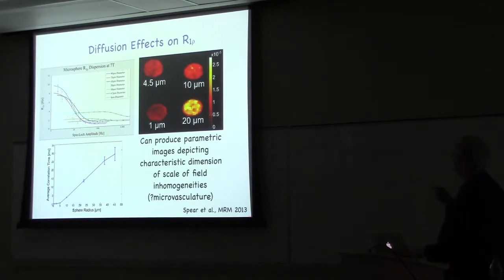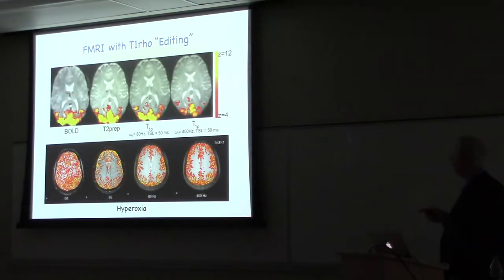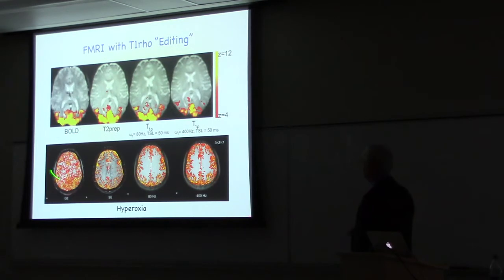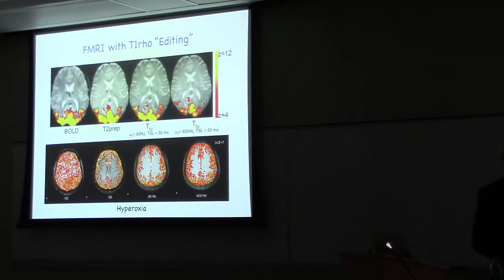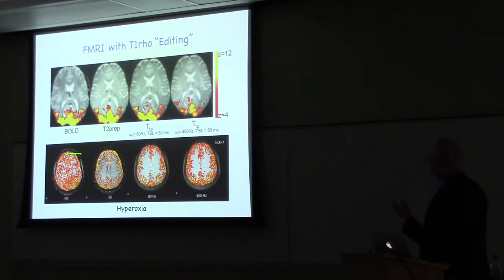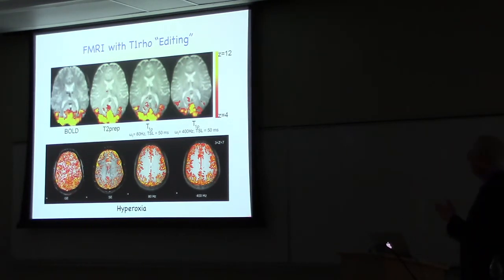When you do this with brain imaging, for example, this is somebody who's undergoing a breathing gas manipulation, so they become hyperoxic. When they become hyperoxic, their oxygen tension goes up, you wash out the deoxyhemoglobin, and you get a signal increase, and what's shown in red are the signal increases that we would measure by different methods. This is the conventional method that would say that everything is changing, but a lot of this is actually dominated by large vessel effects. This is a conventional visual activation experiment where we're looking at V1, but in fact a lot of this is coming from large draining veins.